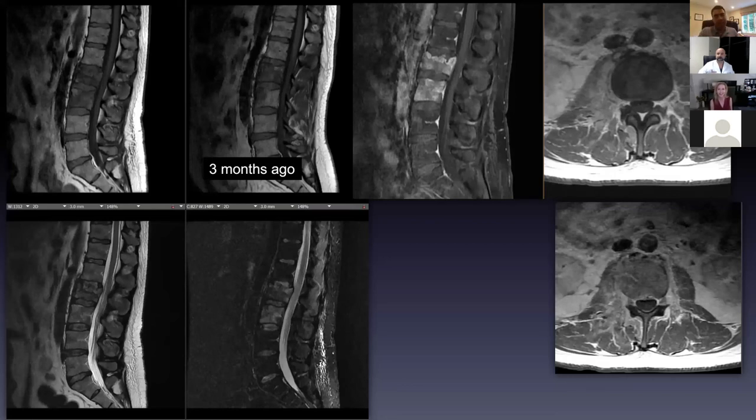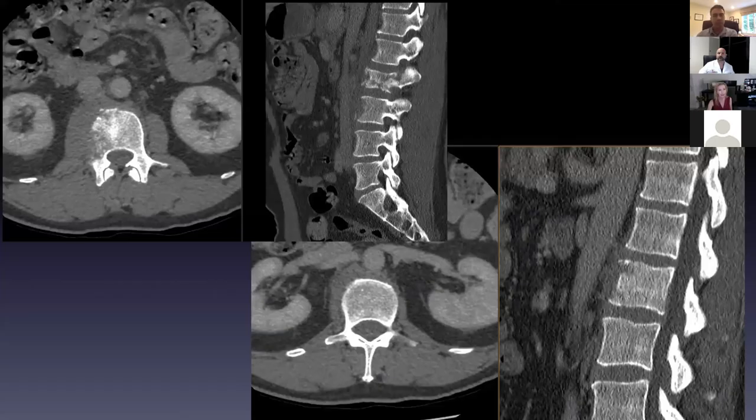I really want to know what it is. And if you want to, sorry, I didn't mean to butt in. I would really want to also get a standing x-ray just to see what this patient looks like. Can a patient stand? They can stand. I don't know that I have an x-ray, but I have CT. That tells you so much, but it's not weight bearing. But it shows quite that it's infection and not cancer. This is infection with permanent changes in the bone.